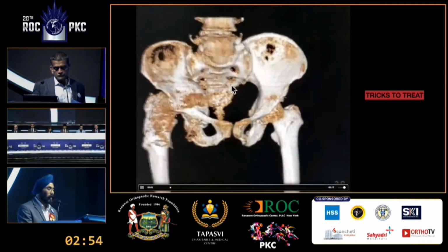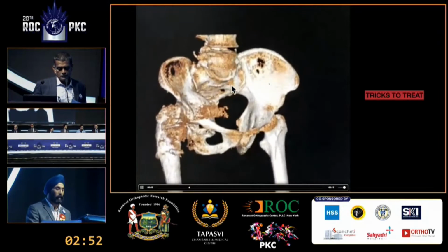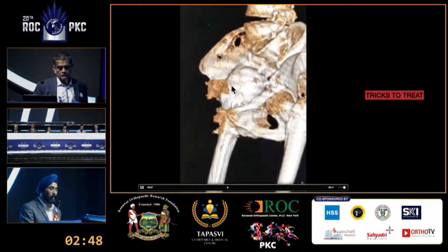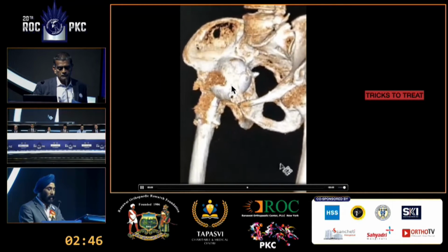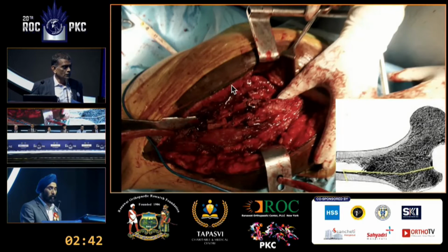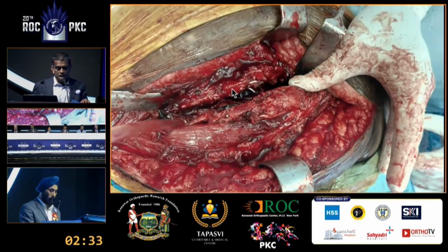Yeah. So the question here was to do with the acetabular loss, then the femoral loss, because there is a gross osteolysis in the femur. There was a fracture in the medial calcar as well as gross loosening. So that's an exposure because there was already a small crack there. So we actually extended the crack. Before you tell us what you did, Mahesh, what is your option?